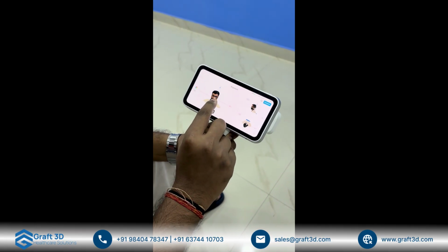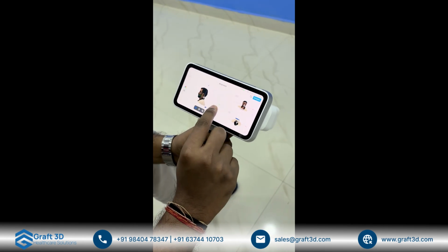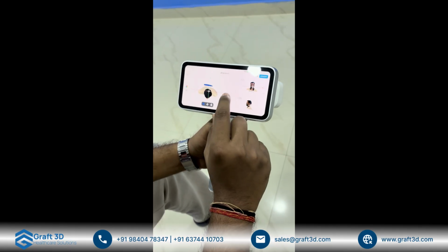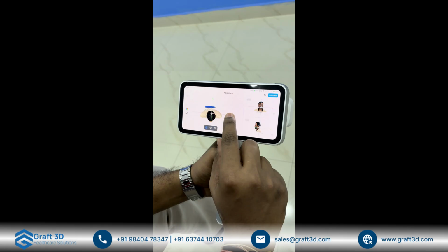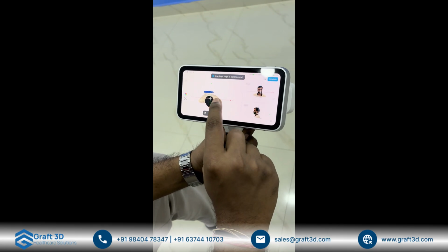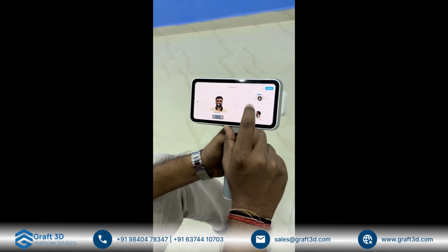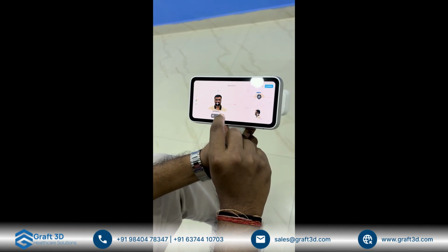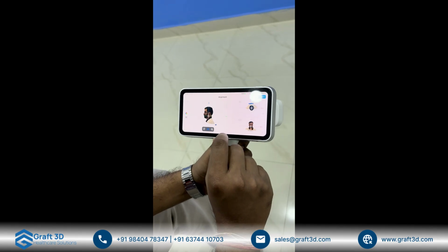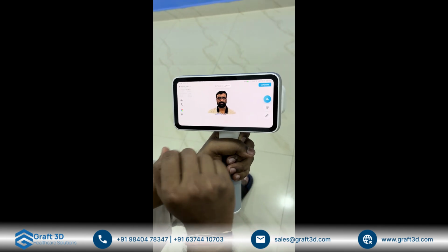So now we are aligning the body. We can align the body with respect to different views. Like this, we can align it. And if I want to align it using this, I can go over here. If I want to translate it, I can translate it over here. So here we are good to go. If required a little bit of modification, I can go on the right side of it. Once the alignment is done, you click on complete.